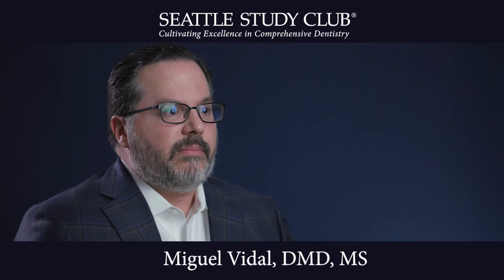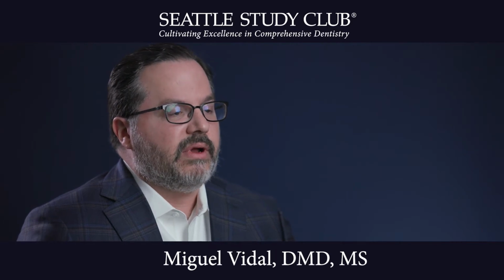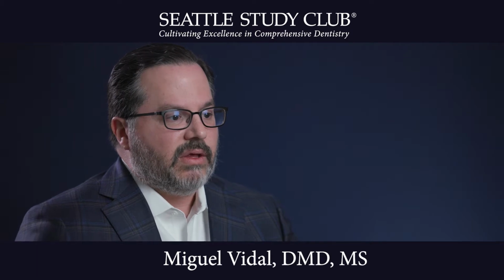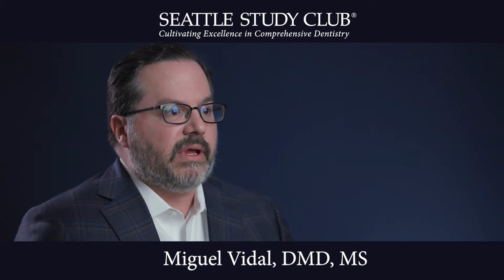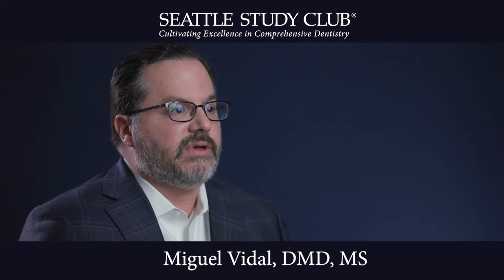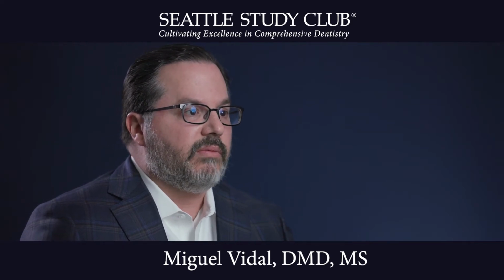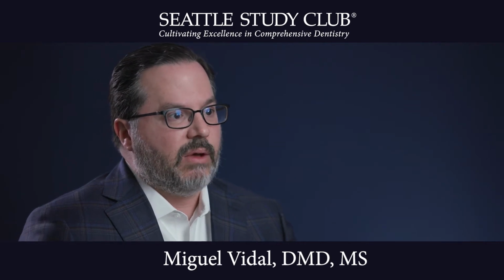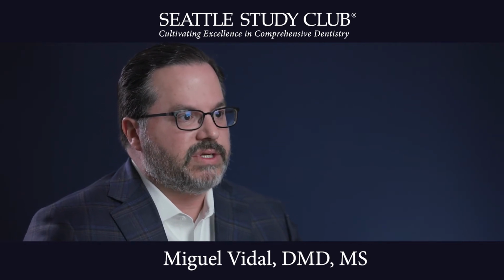So once we've placed our implant and the implant is ready to be restored, we go ahead and take our implant level impression and send that to the laboratory. So we can then design the appropriate abutment and contours that we're trying to achieve. The days of one abutment fits all or the stock abutments are really behind us, and we really need to focus on the patient's specific abutments and what they offer us and, conversely, our patients.